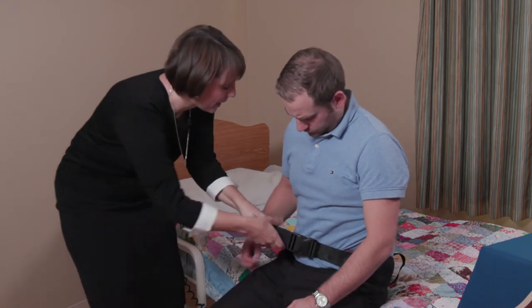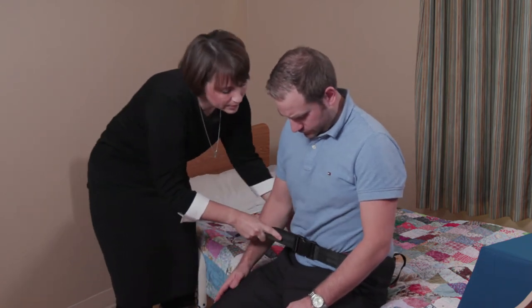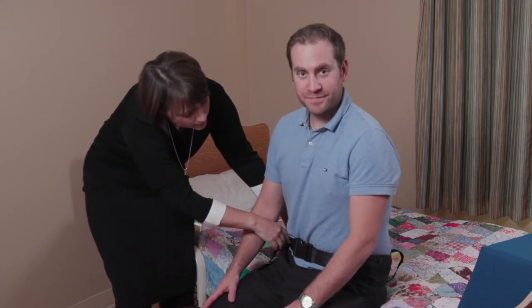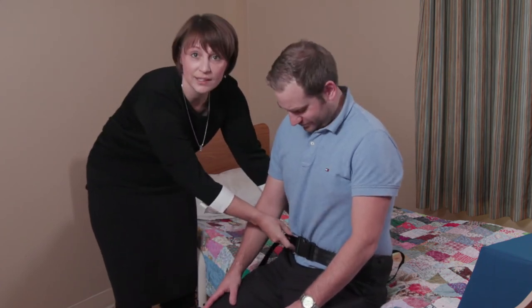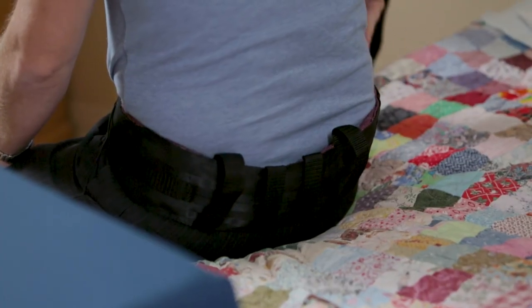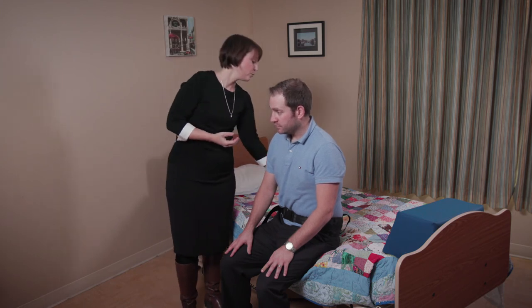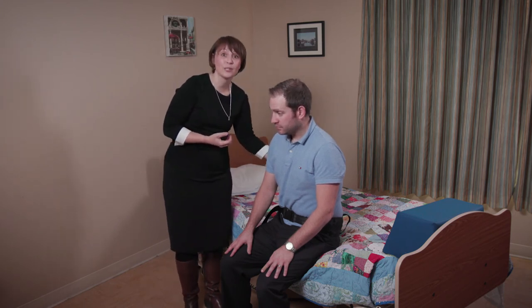So if we pull on that, we're going to pull to snug. How does that feel? Pretty good. You can see that it's sitting nicely on his shirt and it's not moving. When we're ready to transfer Chris, we're going to count that down and we're going to hold through to the back of the loops — and we're not going to lift. We're certainly just going to have a hand placement on that and guide him.